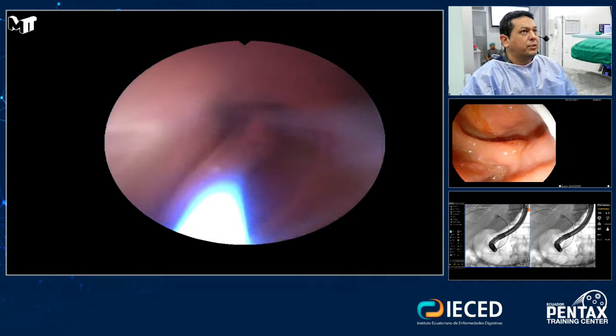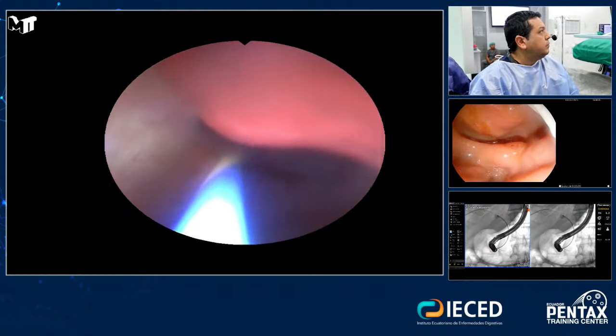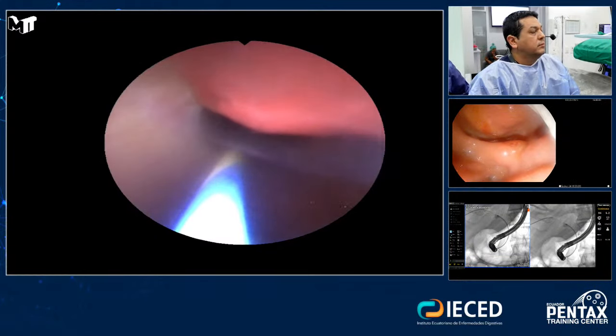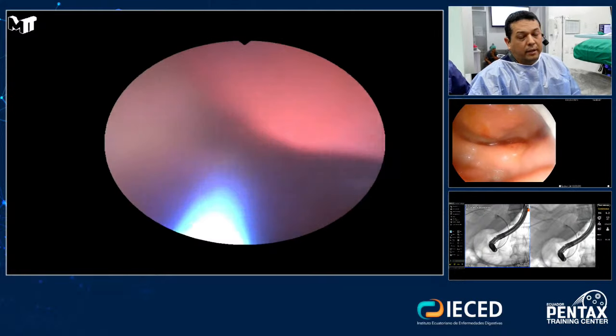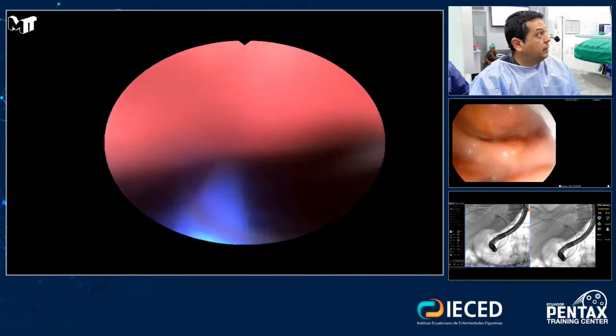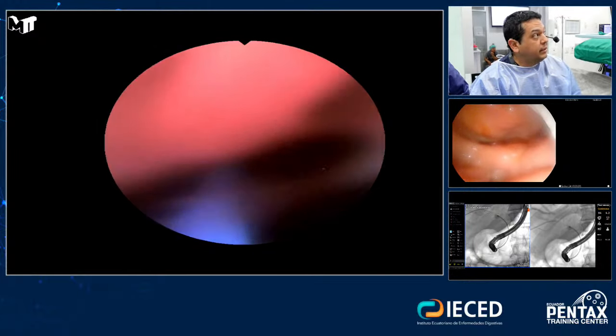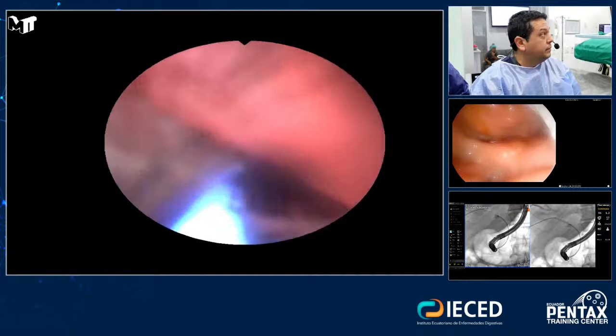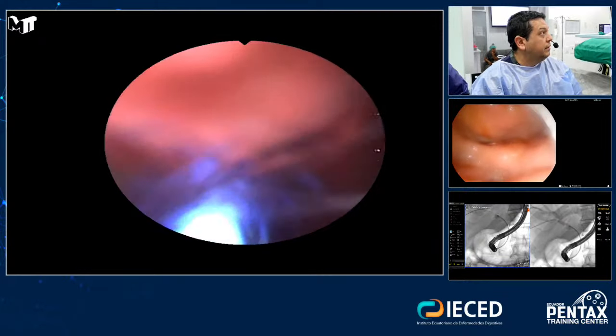Yes, I will use contrast. I want to see very well. And we cannot see the cystic duct.